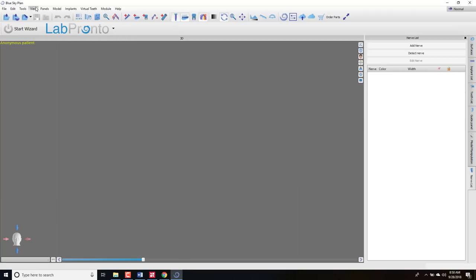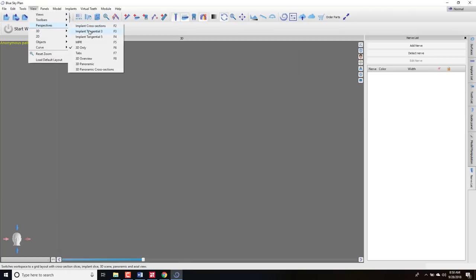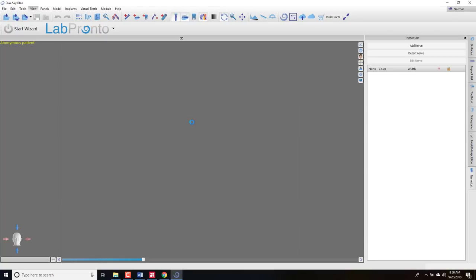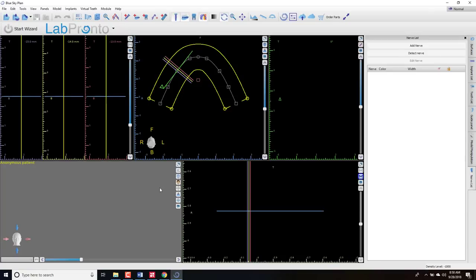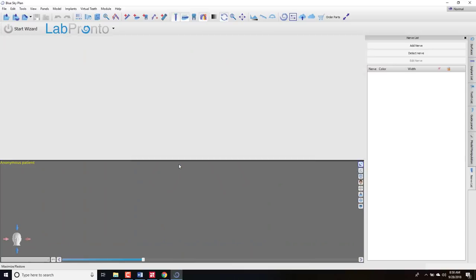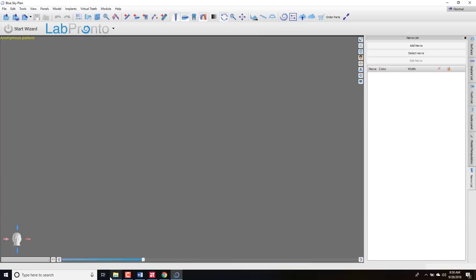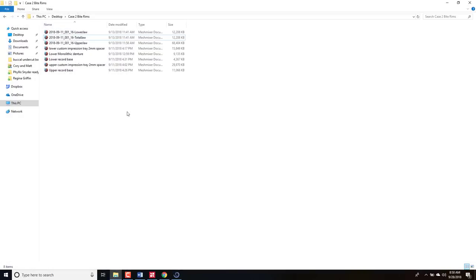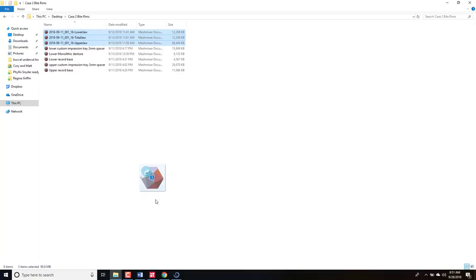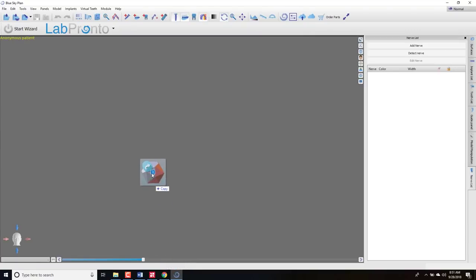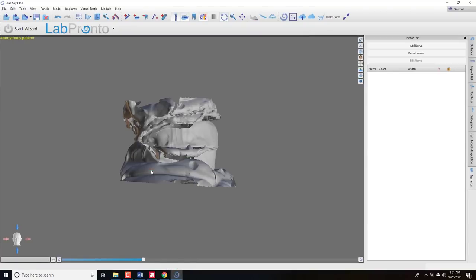This is the basic layout — right now just in the 3D view, but you could go to the standard implant planning view by clicking Perspectives and Implant Tangential Three. For doing dentures, we really only care about this 3D window. So let's pull in the files. I'm going to pull in these three files all at once. There is a total jaw — a scan of the patient of the upper and lower articulated together in some bite rims — and then the lower and the upper independently.